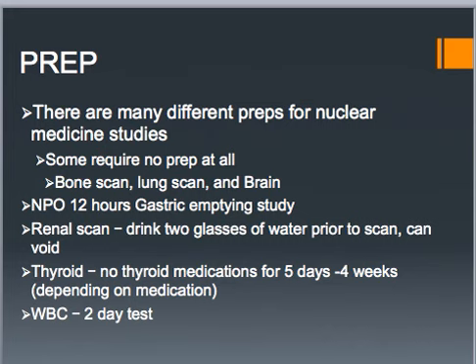There's no prep involved. The renal scans, when you're checking the kidney function, they're going to ask you to drink about 2 glasses of water prior to the scan. But unlike an ultrasound where you have to hold it, with these you can go. They're actually trying to flush the kidneys out so that they can have a cleared out kidney with nothing in there when they go and put those radionuclides in there. And then they'll actually have you drink a lot of water after the scan as well to flush all that out of your system.